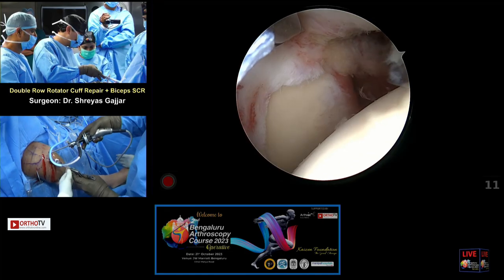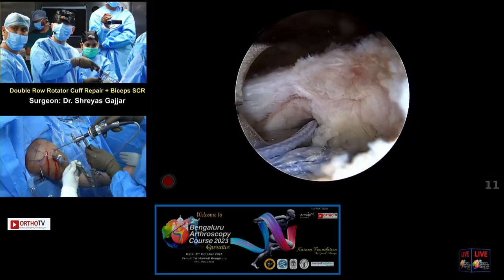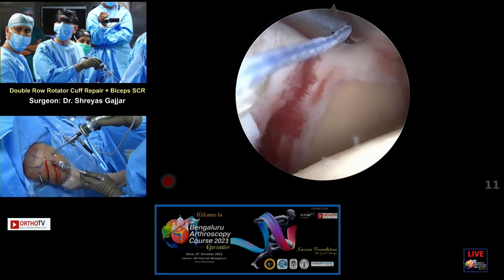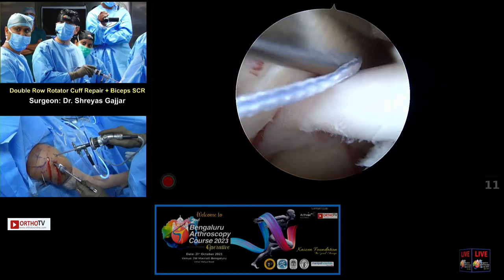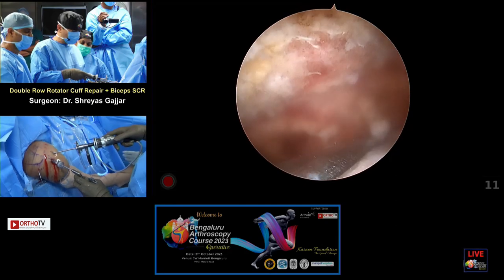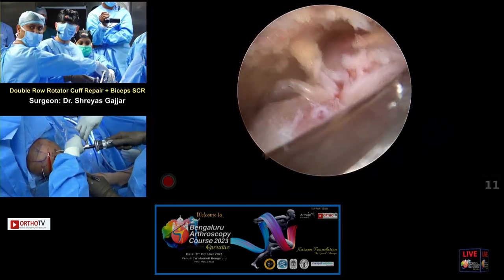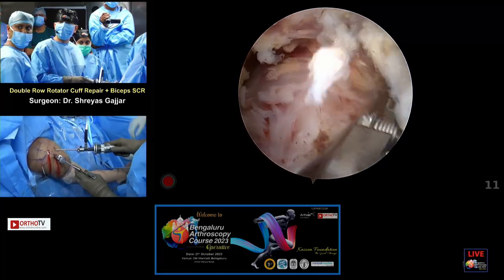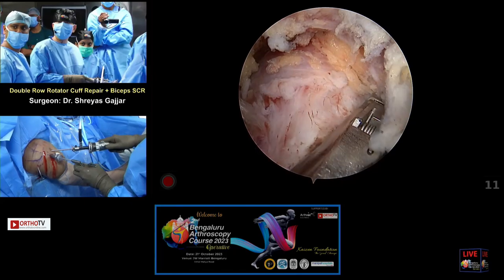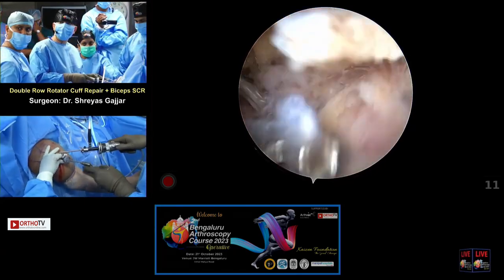Just hold this, please, sister. Yeah, so I've gone above the biceps. Can you see that? Yes, we can see that. Light up, please, vertical. Okay, then I'm passing my second tape just in line with the first one. Hold the cannula, please. Thank you.